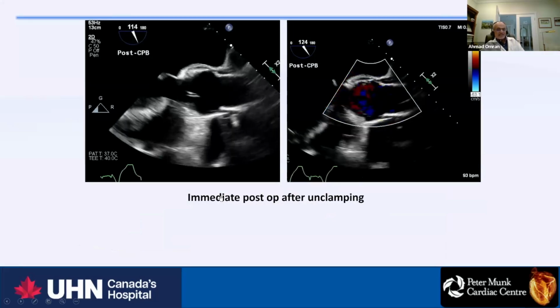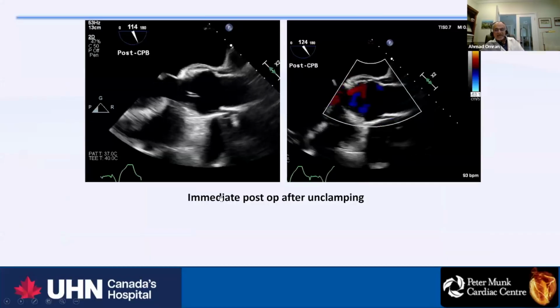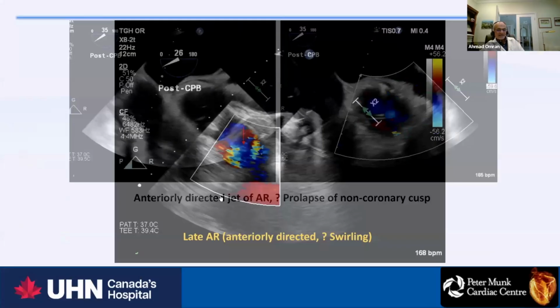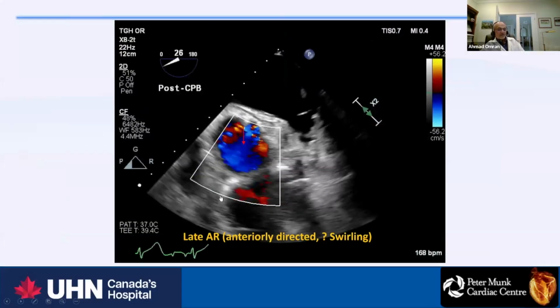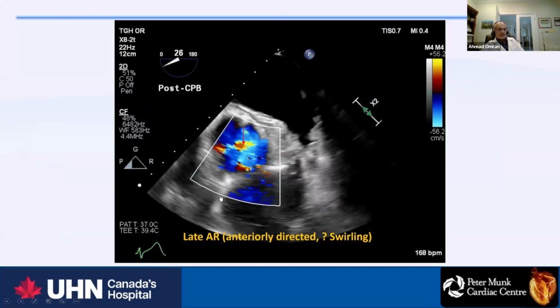Because this is a new valve, it's a pulmonic valve in aortic position. You have to see how this pulmonic valve behaves in the aortic position with high pressure. So there is trace, and wait. It became 2 jets, became a big jet. This is in a 20-minute matter because this valve has to adapt in the new place, and it looks like it is a good leak.